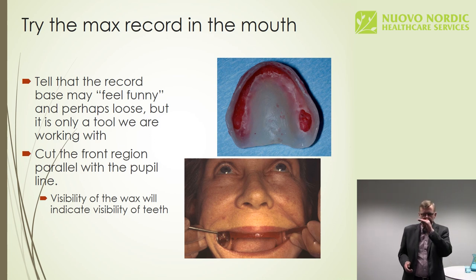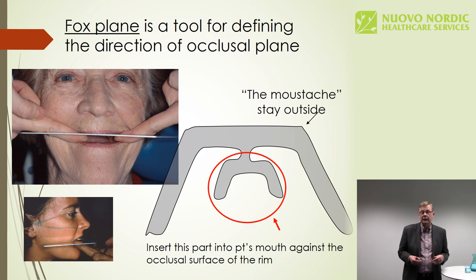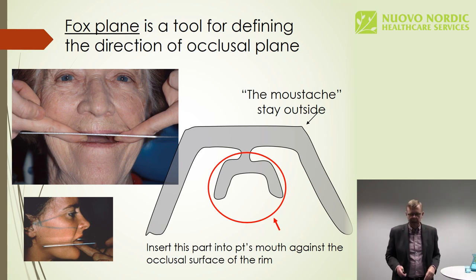So once you are done with the anterior part, the visibility and the lip support are fine. There are some tools for defining the plane. The so-called Fox plane is one. You can use the mirror or any other tool, a ruler, for adjusting the tilt of the plane. Anyway, I personally don't use anything, only my vision. And perhaps I'll stretch the upper lip parallel with the pupil line and in that way compare it with the plane of the wax ring.